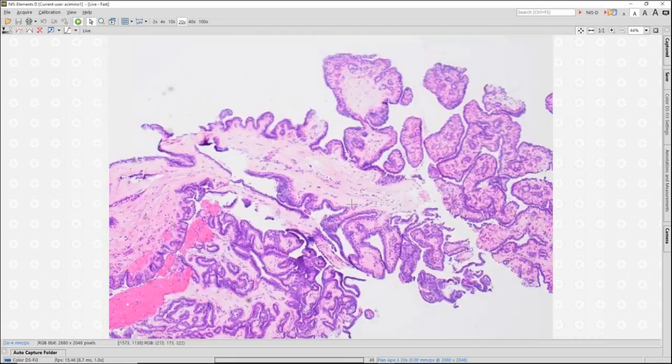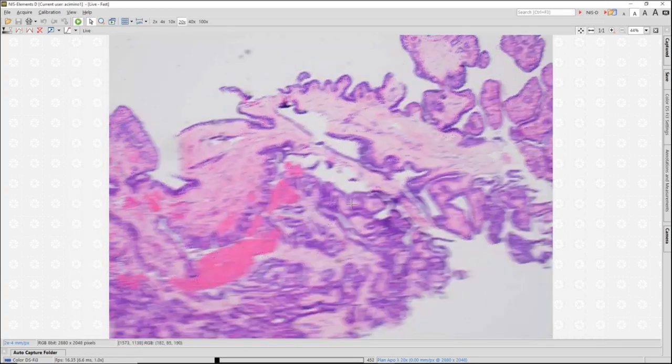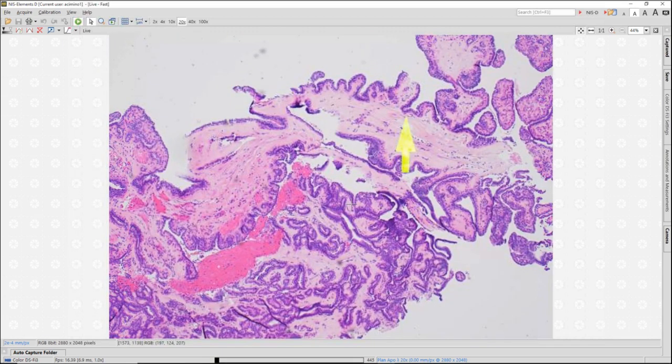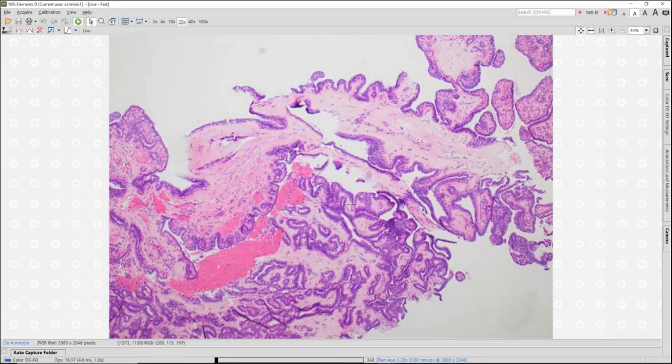The other thing I want to point out while we're looking at this lesion from low power, again, this is a benign intraductal papilloma, is how the lesion appears relatively pink. And I bring this up because we'll contrast it with the atypical papillary proliferations a little bit later. Intraductal papillomas often have very abundant hyalinized and sometimes sclerotic collagenized stroma within the fibrovascular cores. And because of that, and because the nuclei are not atypical, not hyperchromatic, they can appear very pink at low power.